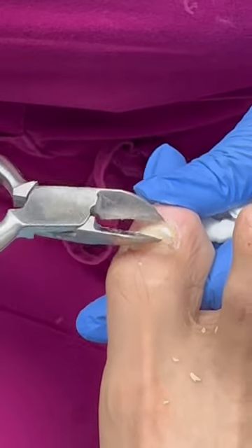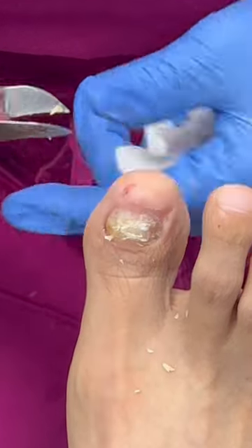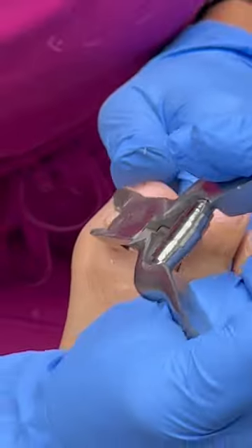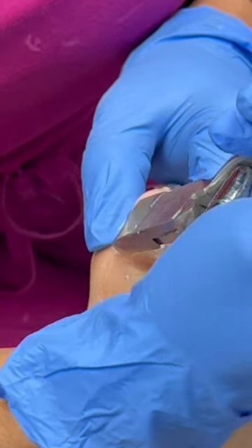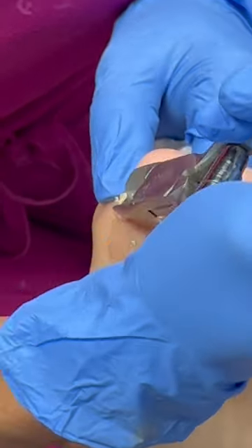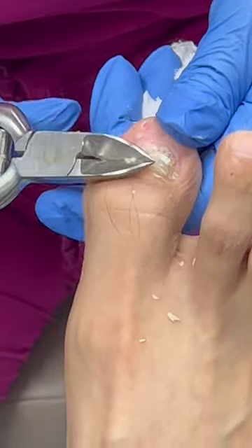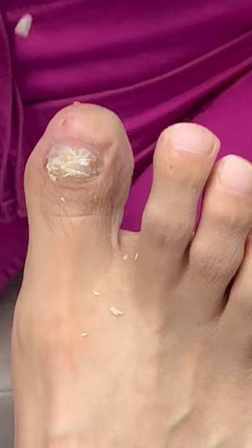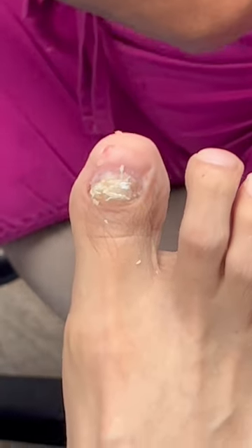You're doing good, I'm almost done here. I'm just gonna smooth it out. This one doesn't feel as crazy as the left one. Well, this one doesn't have as many layers to it. I just need to make this one smooth. She nearly lifted the whole thing off!